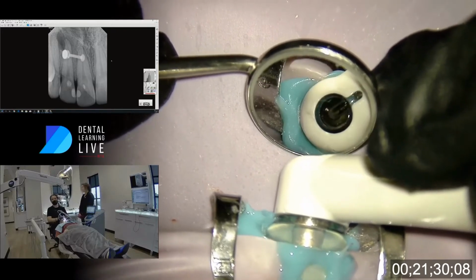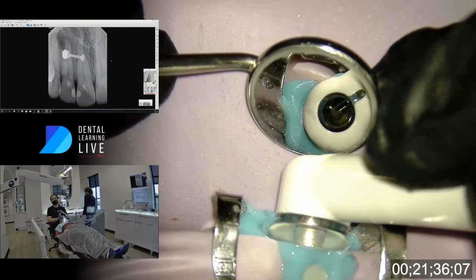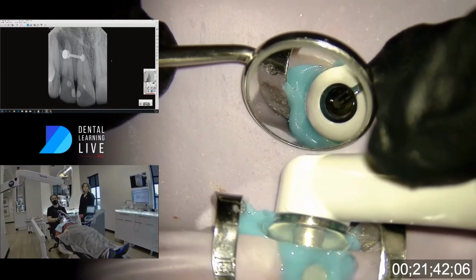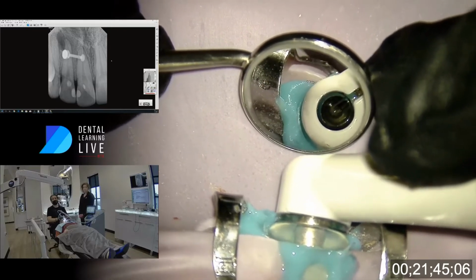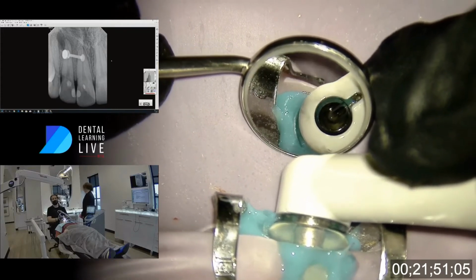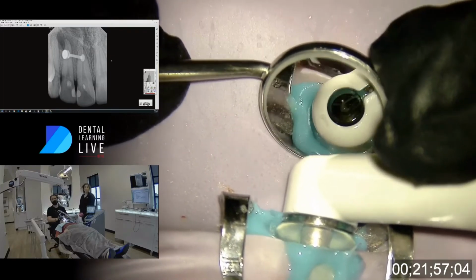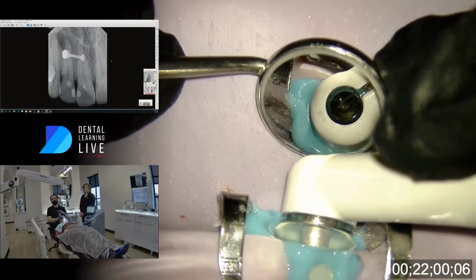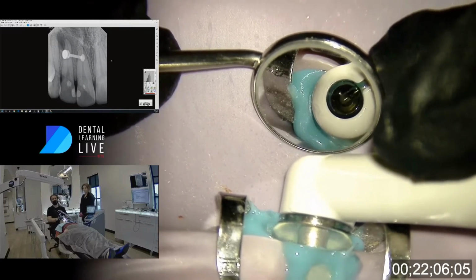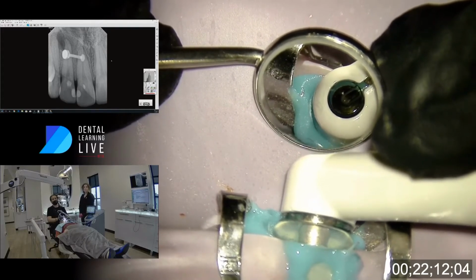So what happens is you have basically this sound flow that's coming through this handpiece at very, very high speeds. And it's hitting this sound bar, and what it does is when fast-moving current hits kind of stagnant water, you create shear force. That shear force is what we get the word cavitation from. Now that cavitation bubble is what we're looking at. That little dancing bubble that I've been describing is the cavitation cloud. Now, it's not that that cavitation cloud is going all the way down the tooth. It's actually staying put. And that feature of that cloud collapsing and reforming generates lift and sound.